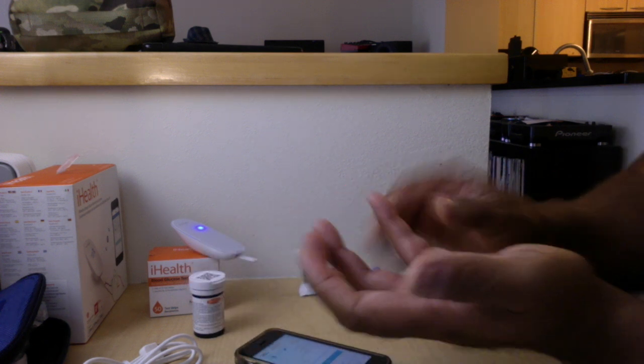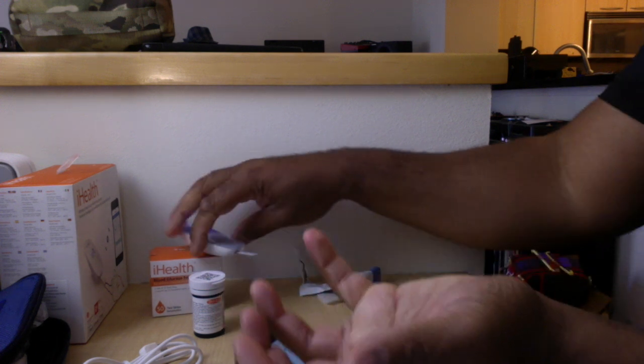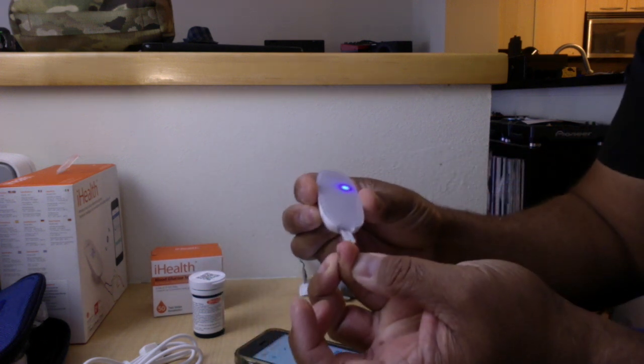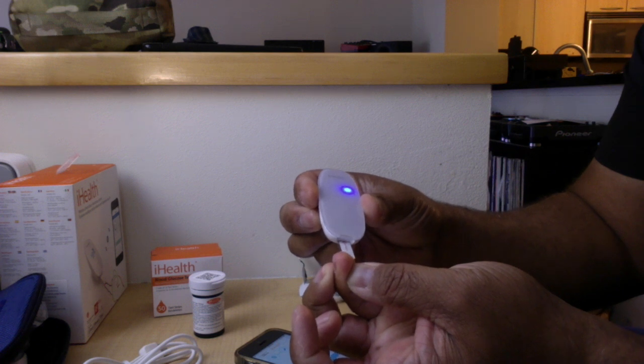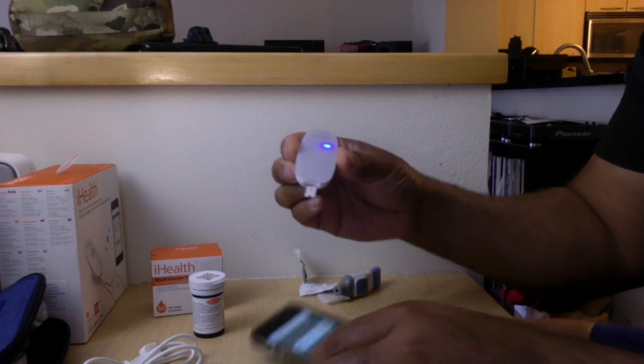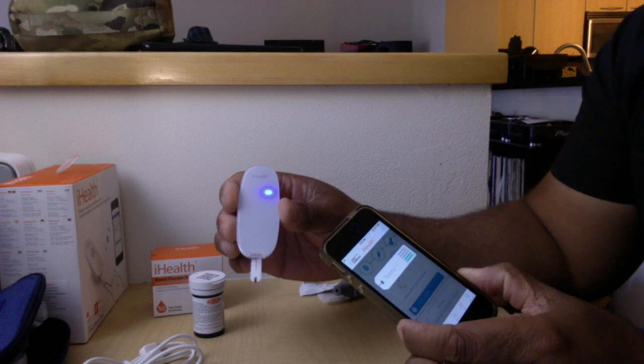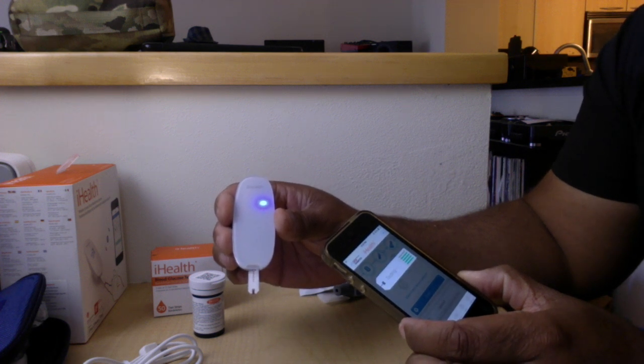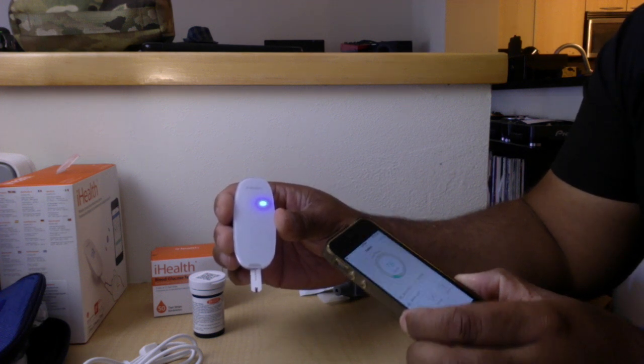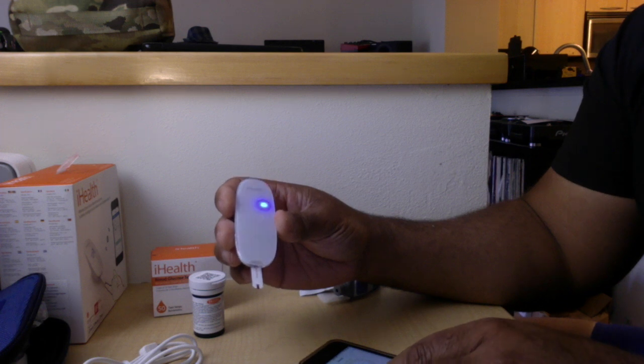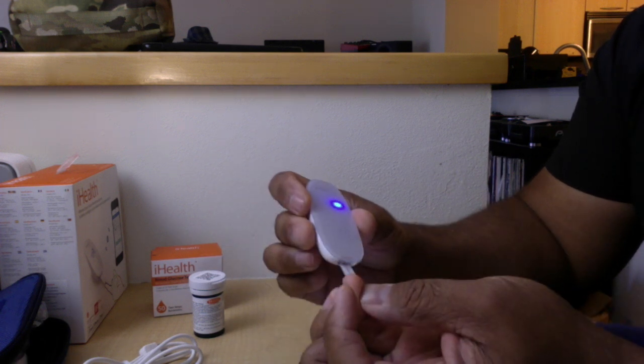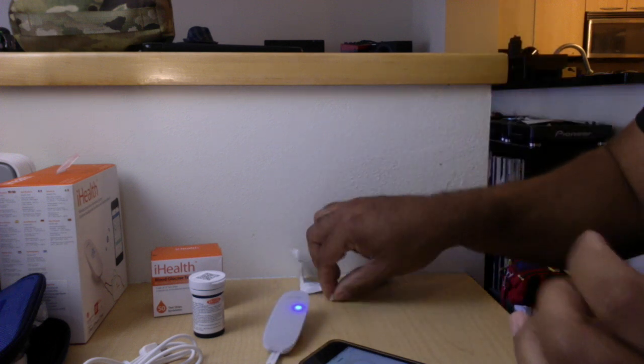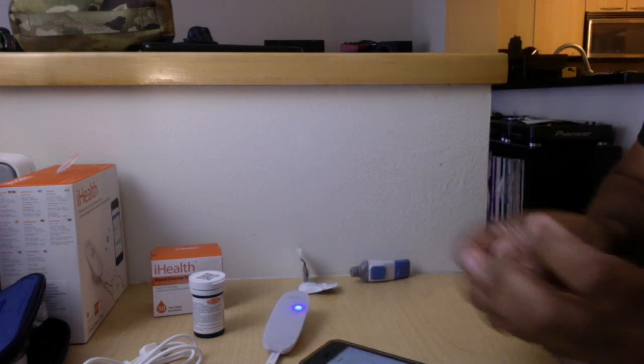All right, I got it. Okay, so we'll see how fast this goes. Okay, there it goes. Made a little beep. Okay, so it says 78. I think that's good. I think I got blood all over the place. That's pretty low.